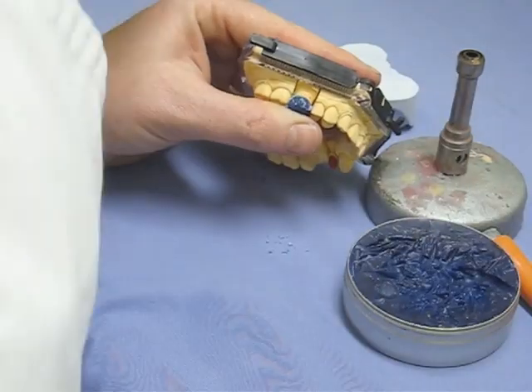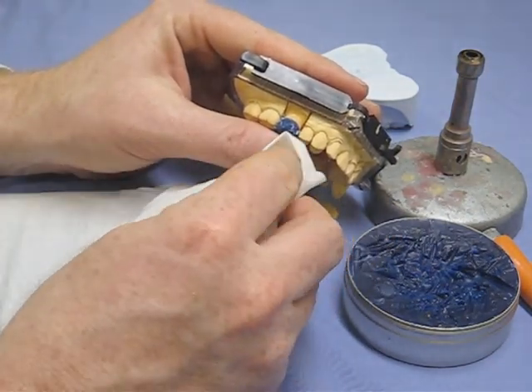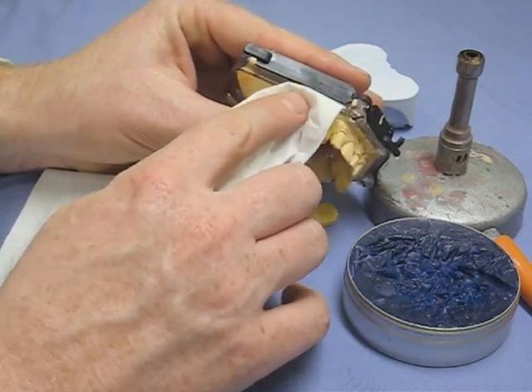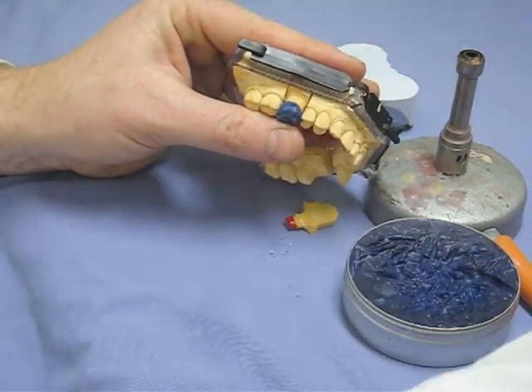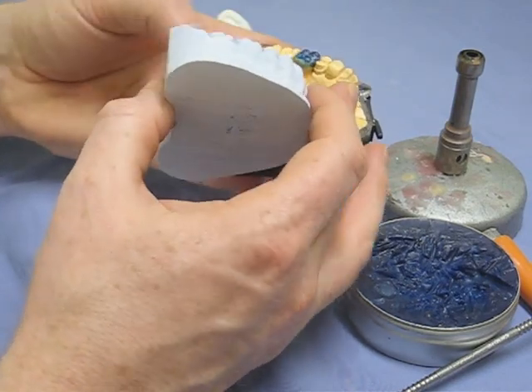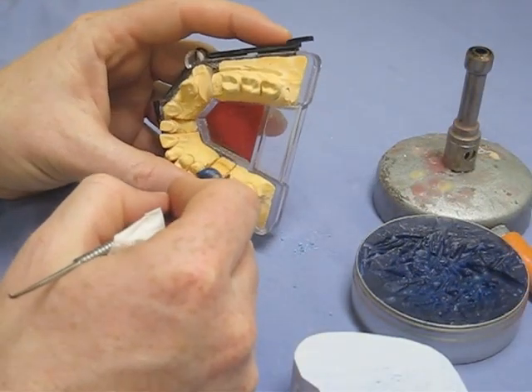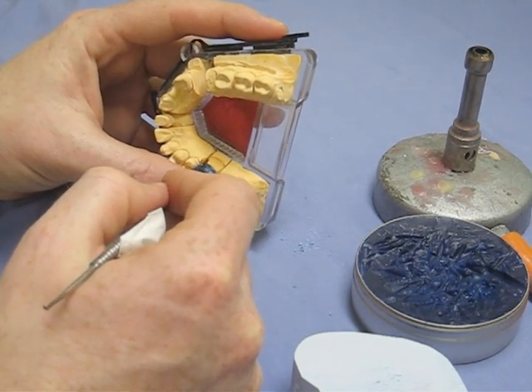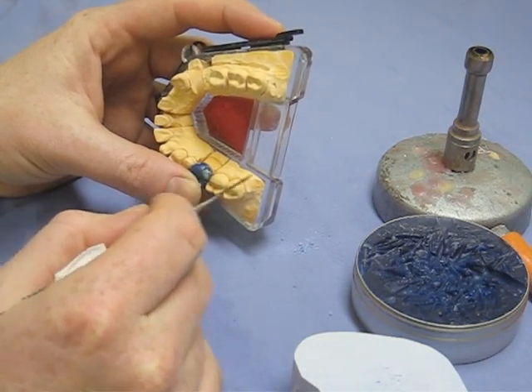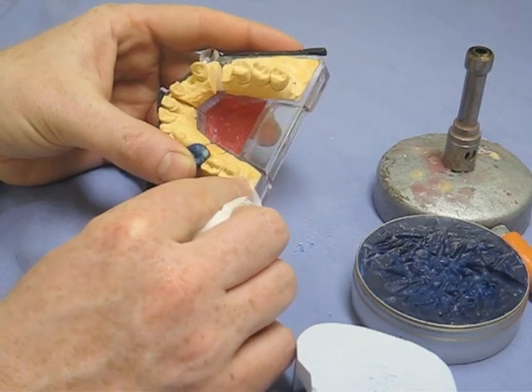Just cleaning everything up now, giving it a contour around the buccal areas, getting the shape right, and making sure the cusps are the right shape. Using a little bit of tissue — you'll remember this from first year — to polish it up. That should be the buccal aspect of the crown done. Now we repeat the process for the palatal cusps, and then we'll be on to the occlusal surface. You've already made a start and are doing the distal palatal surface now.